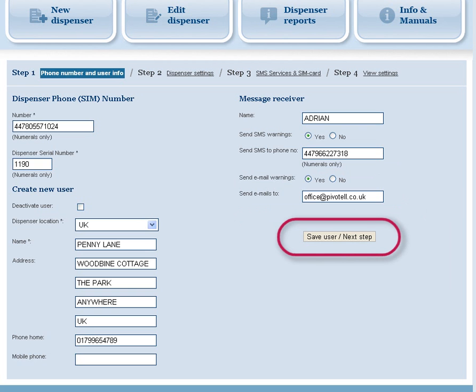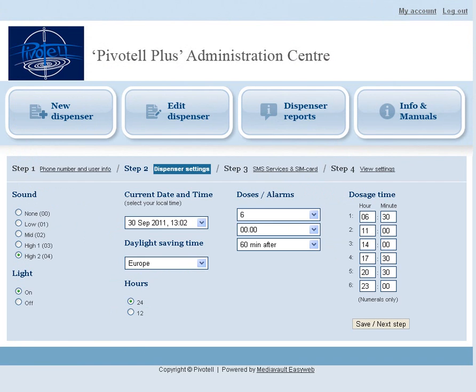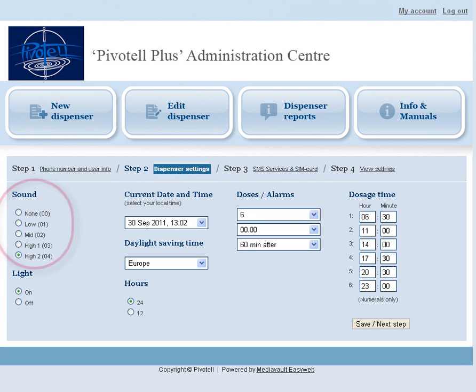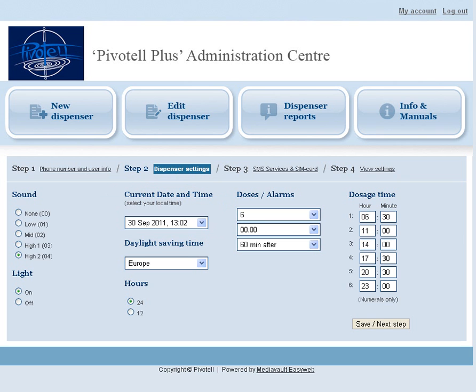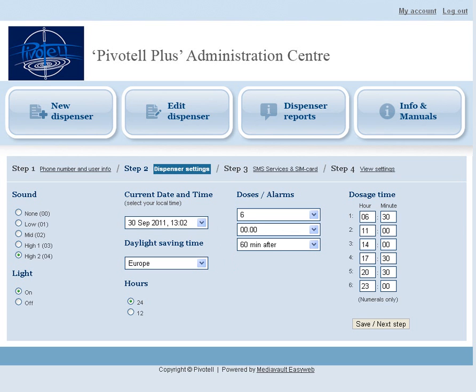Click Save and the screen will move to Step 2, Dispenser Settings. Select the required sound — High 2 is the loudest — and whether the flashing light is to be on or off. The current United Kingdom time will be correctly displayed in the current date and time field. Select Europe for automatic daylight saving time adjustment. We recommend that the 24-hour clock is used.